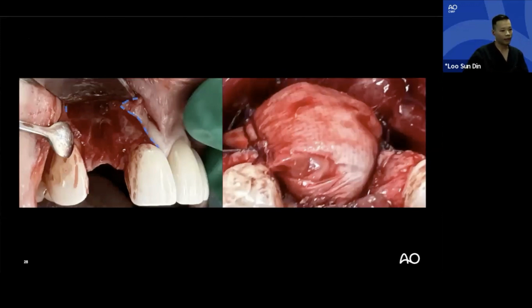After raising the flap, what we see is this. This is the bone defect. Minimal palatal bone left, a through and through hole occupied by soft tissue. I did a rib roast or sausage technique GBR with cross-linked membrane and periosteal suture stabilization.